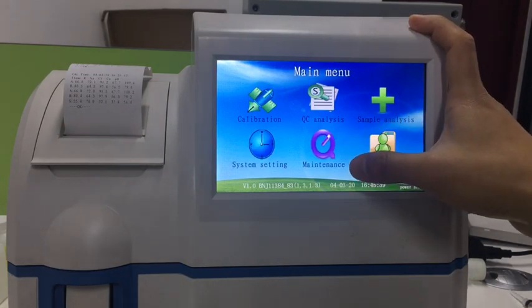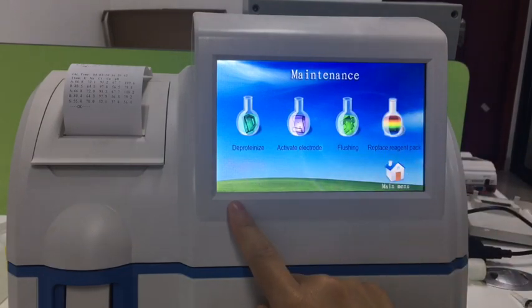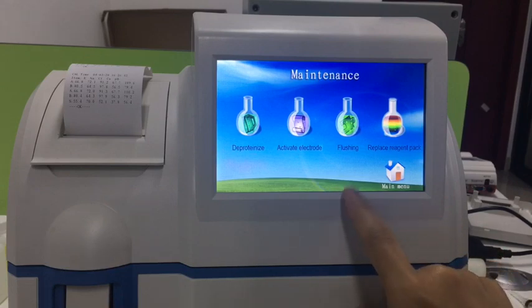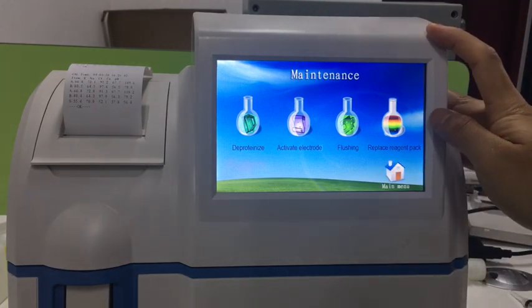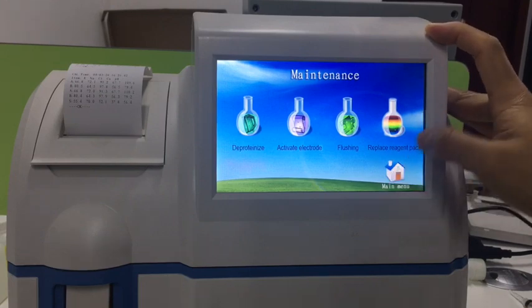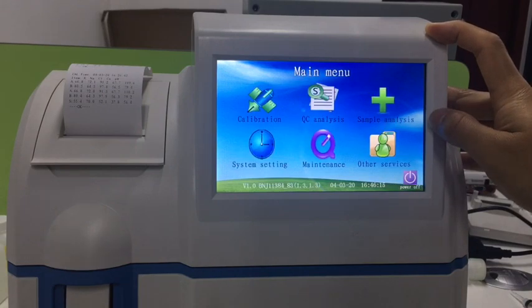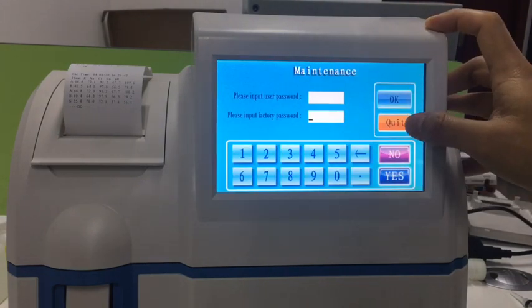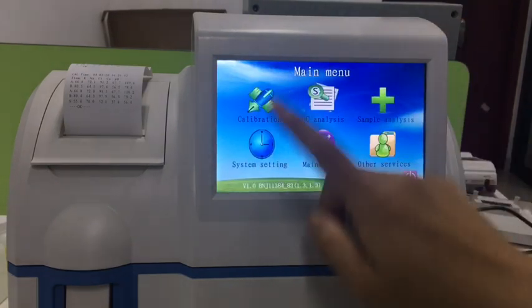Here is the maintenance section. The options available include deprotein, activation to activate the electrodes, flushing before shutting down the machine, and replacing the reagent pack when it runs out. For other advanced settings, go to other services, then advanced tab to access those settings.